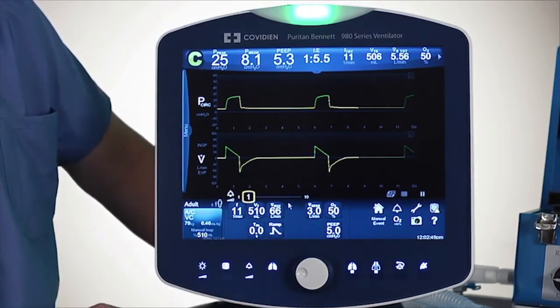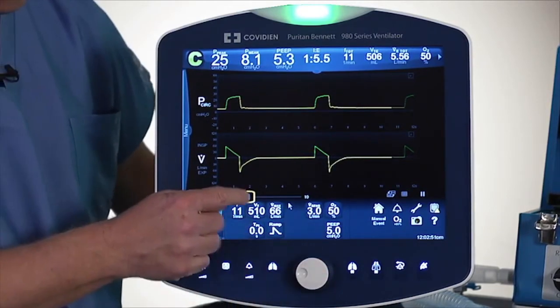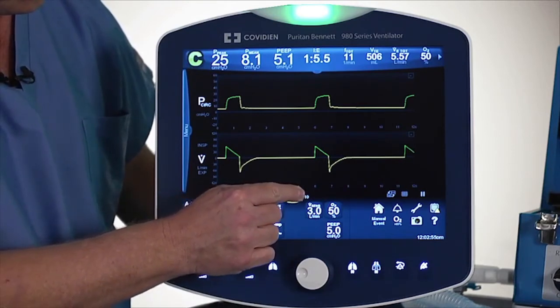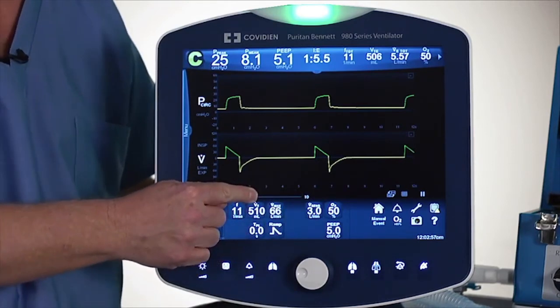The next one is the alarm volume. I can use the knob or I can use my finger on this. That can get pretty long.